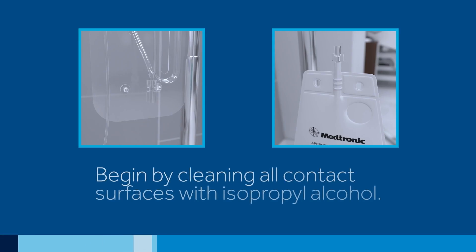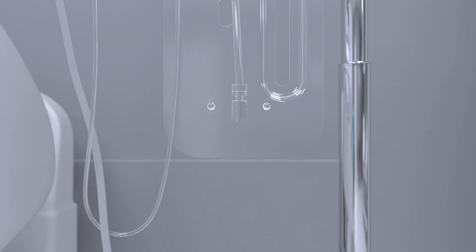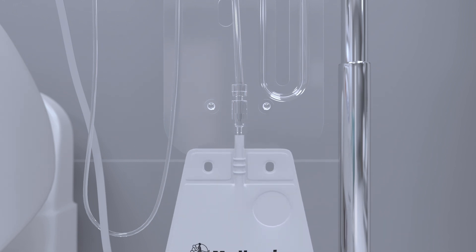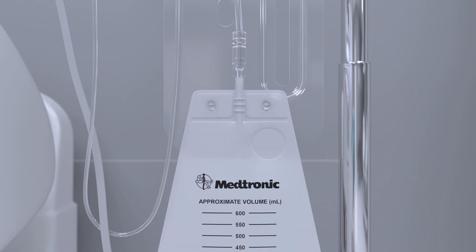To replace the drainage bag, begin by cleaning all contact surfaces with isopropyl alcohol and allow to air dry, usually 30 to 60 seconds. Then, with the drainage bag rotated 90 degrees, insert the drainage bag connector into the luer lock fitting and rotate the bag 90 degrees to the right or counterclockwise. Be sure to finger tighten only and do not use instrumentation to connect or disconnect the drainage bag.